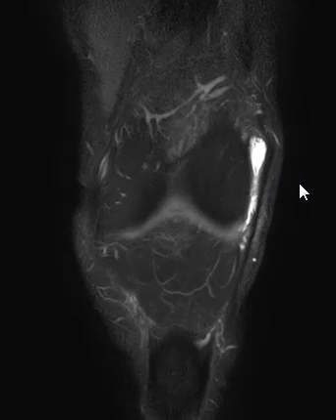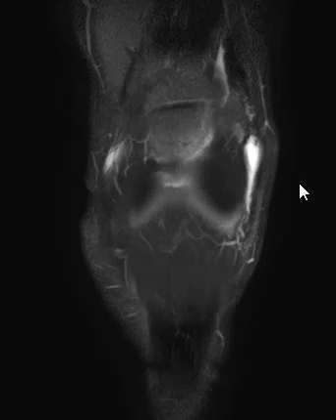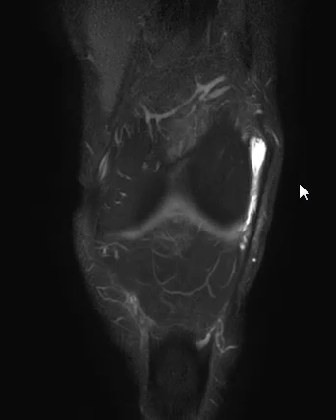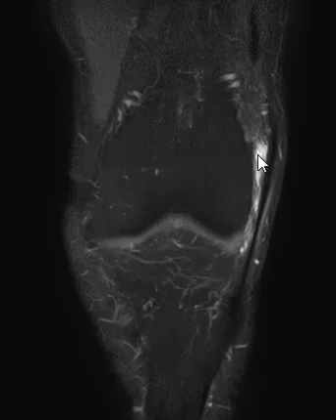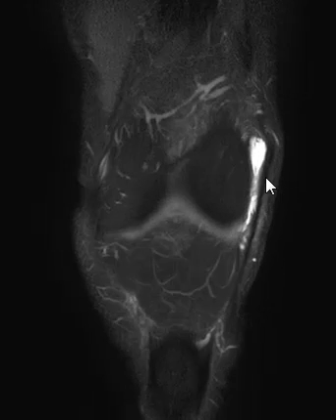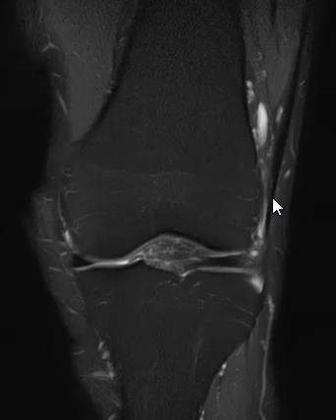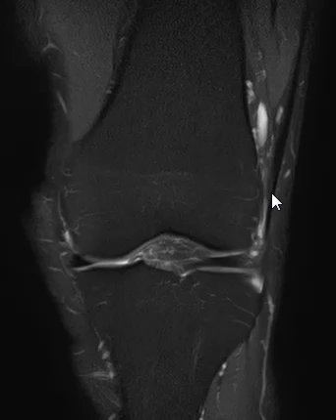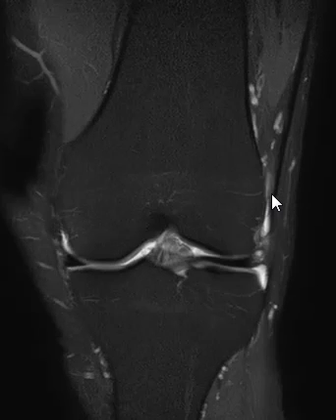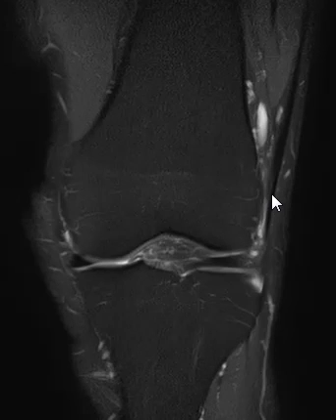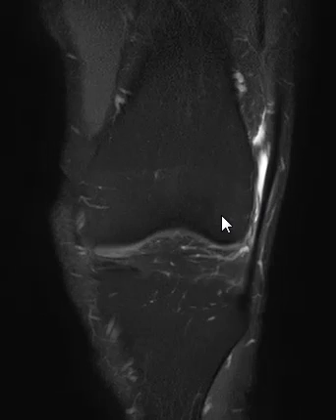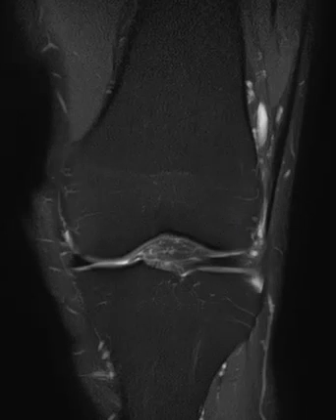This is a diagnosis of iliotibial band friction syndrome — the iliotibial band rubbing against the lateral femoral condyle and kicking up a little complex burst of effusion here, probably related to altered mechanics of weight bearing. A lot of times we see this in runners. Thank you very much.